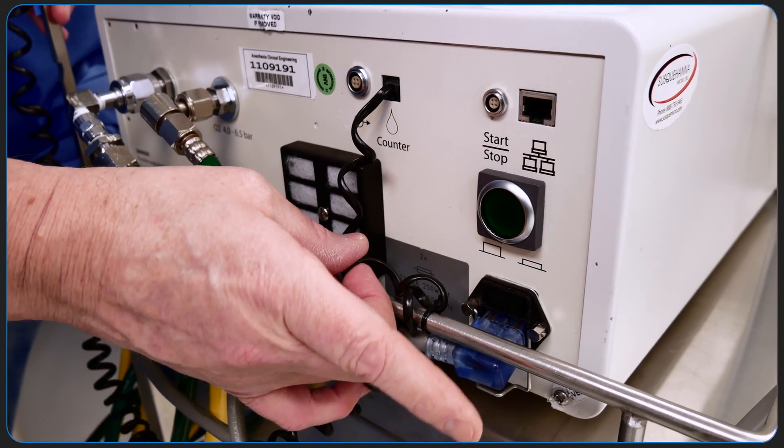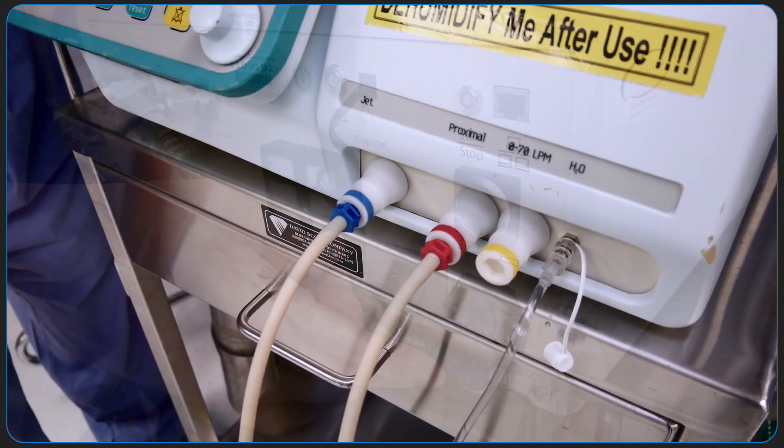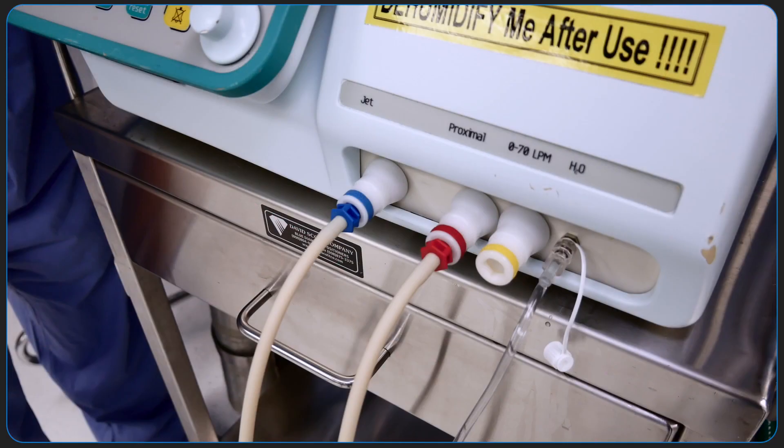Press the start-stop key on the back of the machine to start the ventilator. The blue and red tubing need to be connected to the machine before turning it on.